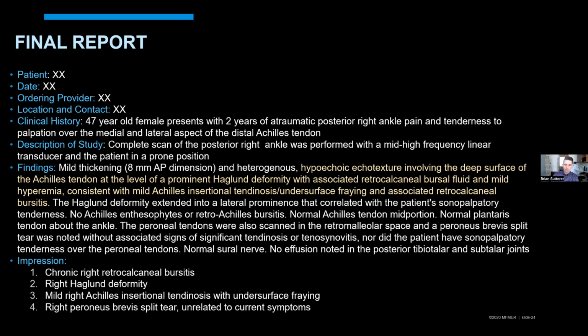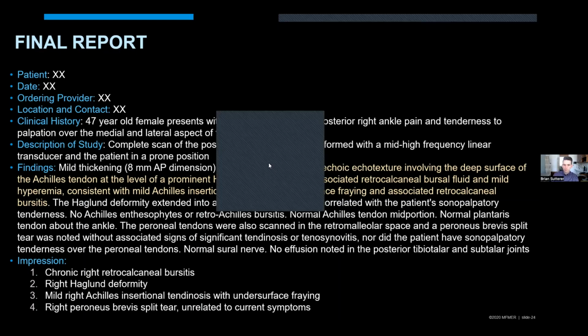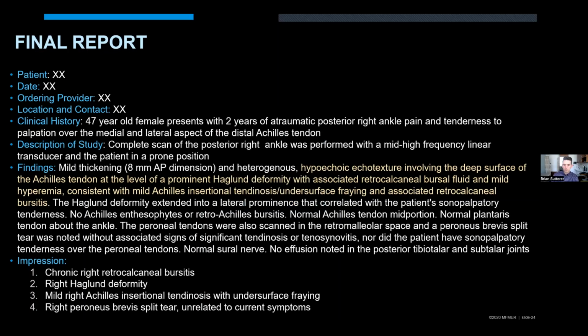So, discussion regarding that. Jake or Brendan, you guys see a lot of these. Anything to add? Hey, Doug, can I ask you a quick question? Yeah. So you mentioned looking for a low-lying soleus. I'm just curious if you have any objective way to identify a soleus as low-lying versus not.